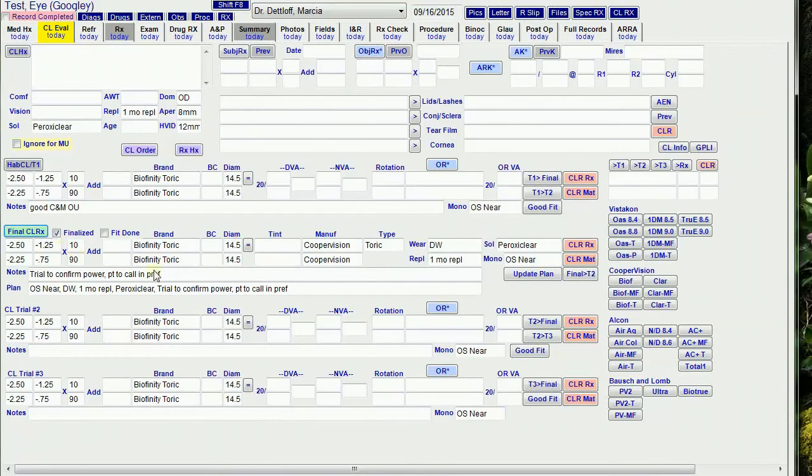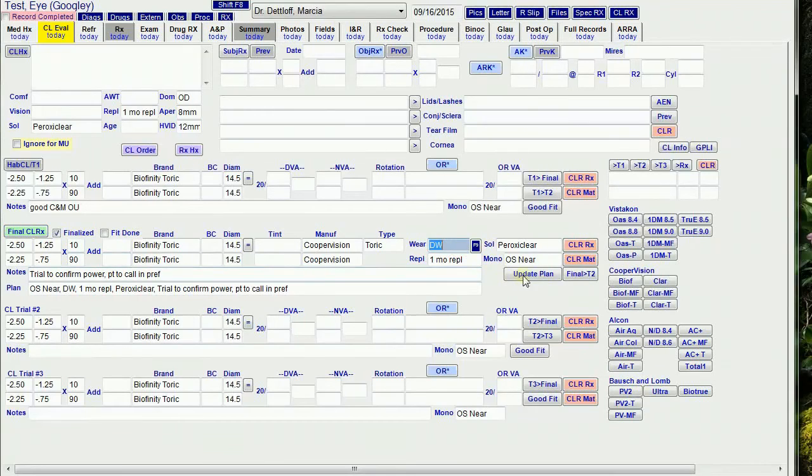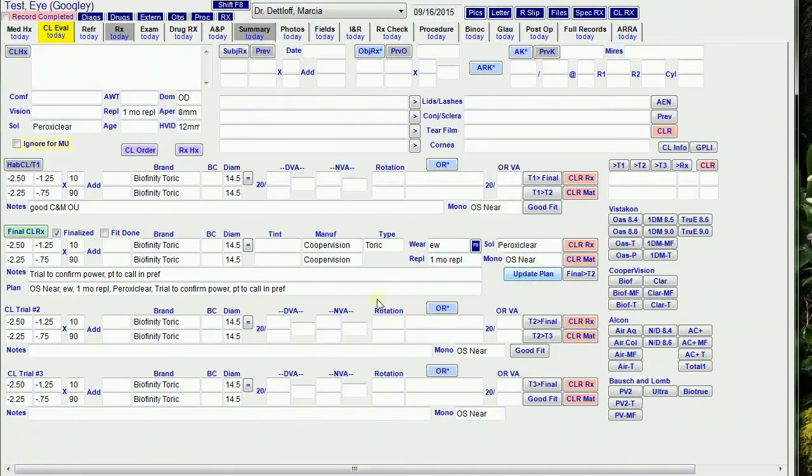If I want to change the wear, replacement, solution, or mono fields after I've finalized, I can use the update plan button, and that will update the information in the plan without displaying the RX window.